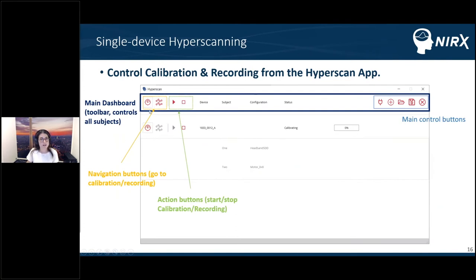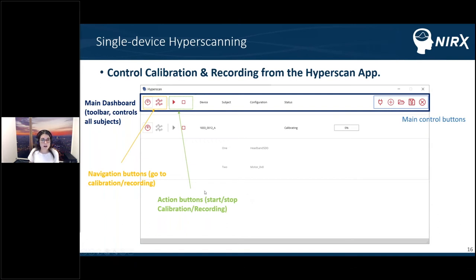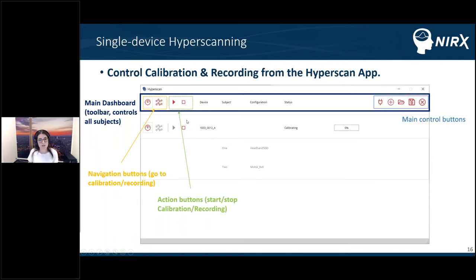The main dashboard has navigation buttons to go between the calibration page and the recording page, and depending on which page you are on, you have different action buttons to start or stop calibration and recording. If you have more devices with different subjects and want to run calibration for only one specific device, you can use the subject dashboard instead of the main dashboard — navigation and action buttons work the same way there.